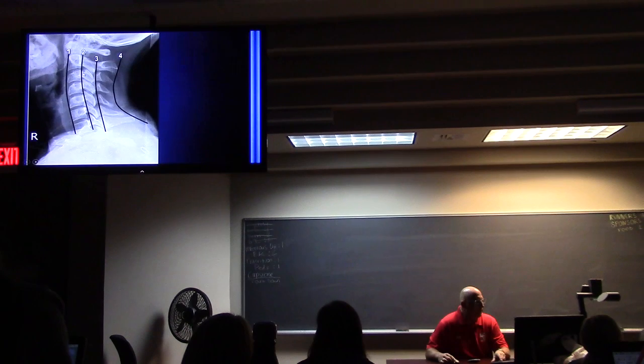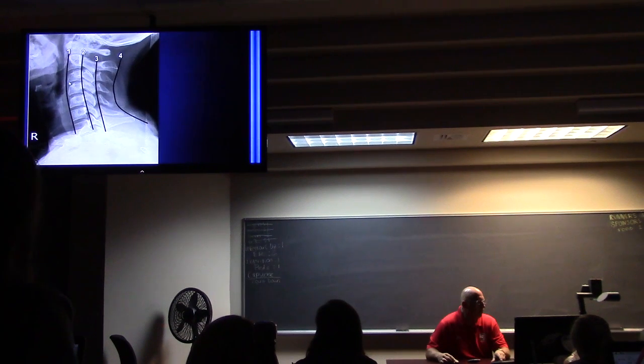Anterior vertebral line, posterior vertebral line, spinal laminar line, tips of the spinous processes, soft tissue at 2. There's the ring at 2 right there. It's nice, beautiful. 2, 3, 4, soft tissue at 5. That's a little bit generous, but I don't see anything else.